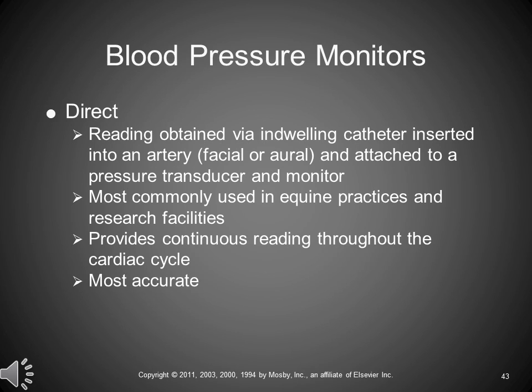They are by far most commonly used and most applicable in equine practices. Okay, you can use them in small animal practice, medium to large size dogs. It ain't always easy, but you can use it. They are by far the most accurate, and they provide continuous reading throughout the cardiac cycle.